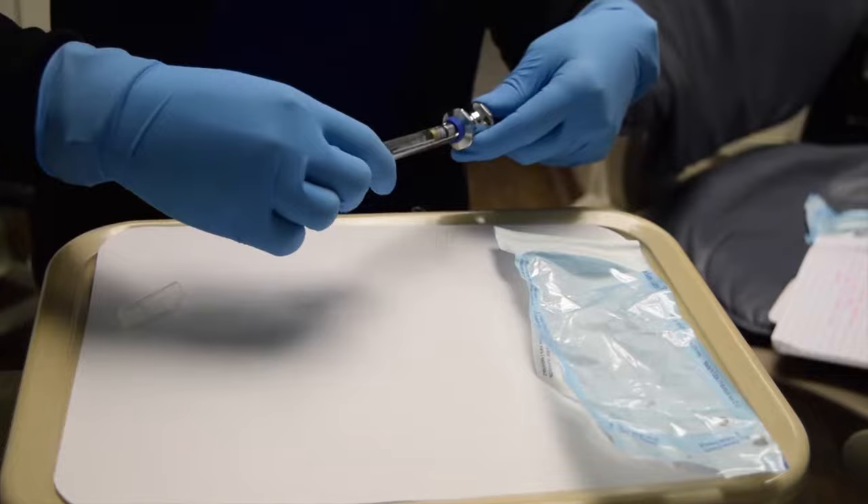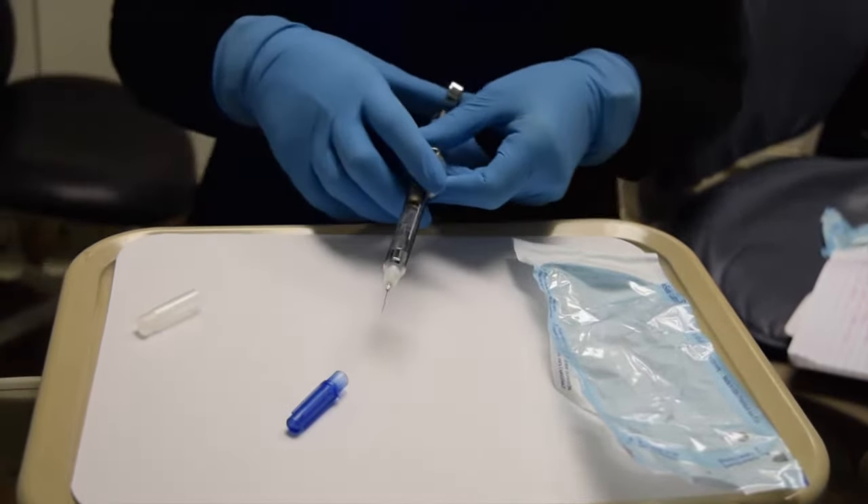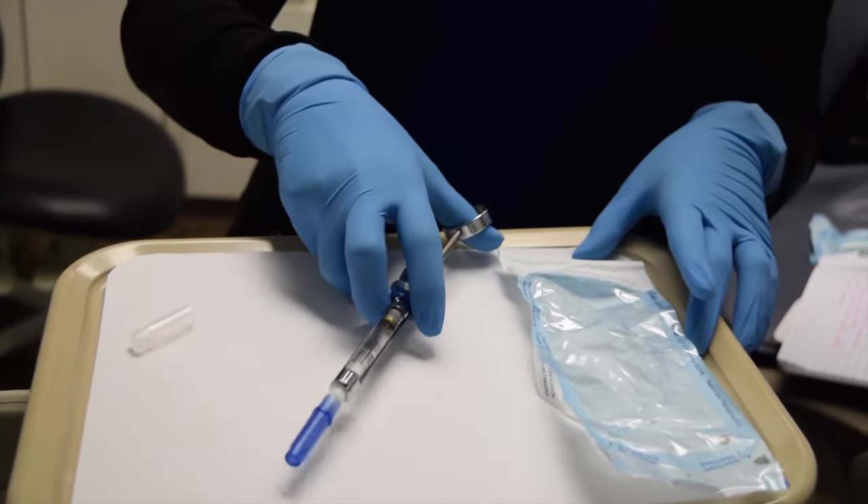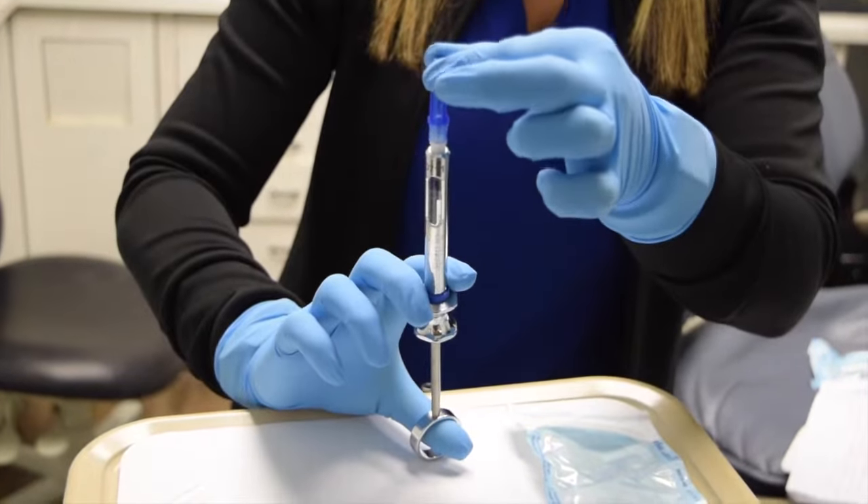Once it's done, to ensure safety, you will use the single-handed scoop method. You will insert the needle into the cap, place it upright and push down.